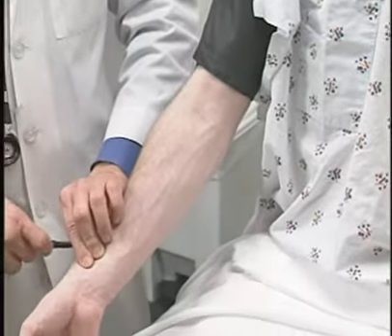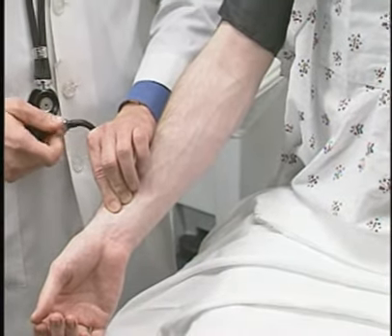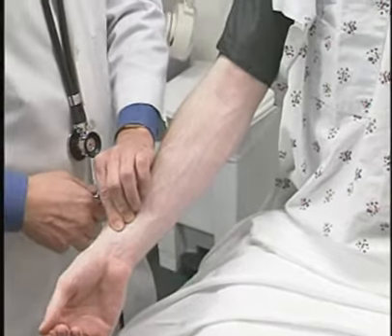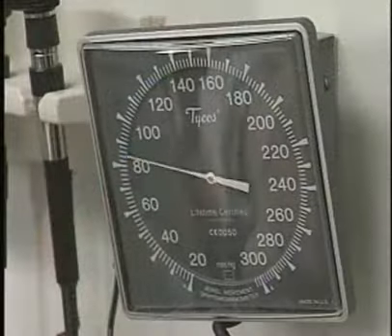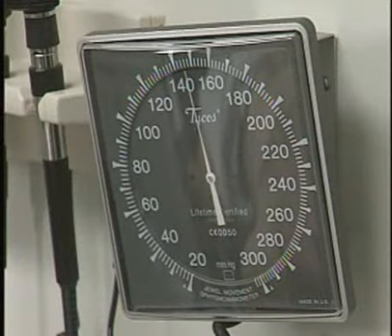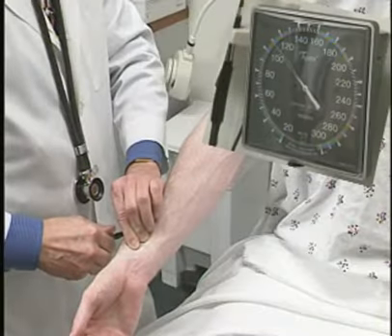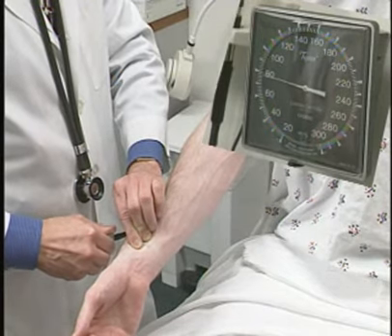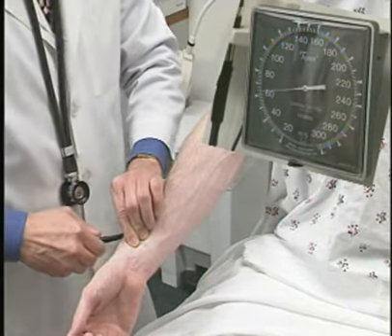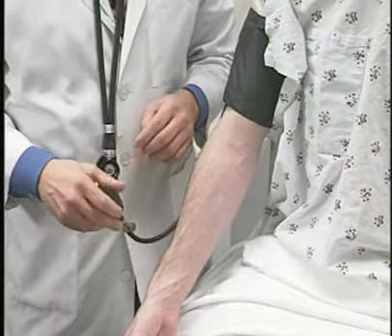Simply identify the radial pulse, tighten up the valve in the blood pressure cuff, and by watching the sphygmomanometer, I'm going to determine when I stop feeling the radial pulse and blow up the cuff approximately 20 beyond that. And I felt the pulse disappear about 110. As I released the air from the cuff, I felt it return about 110. This tells me that the systolic blood pressure is approximately 110.